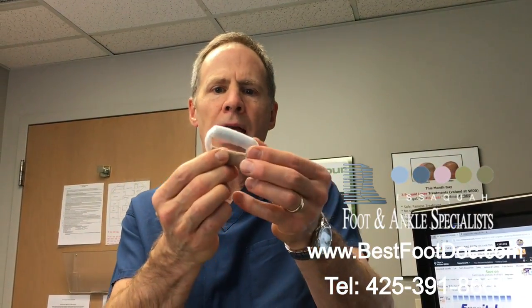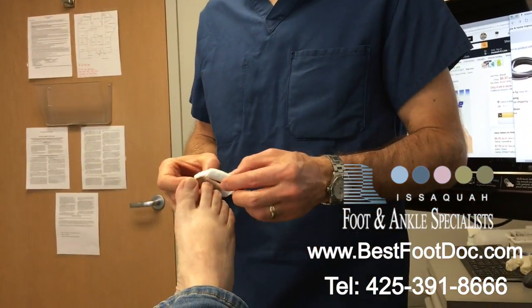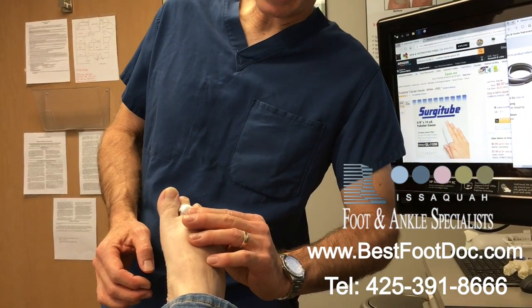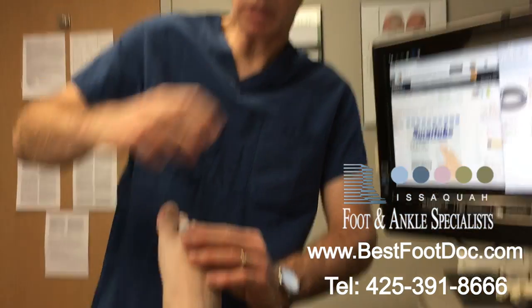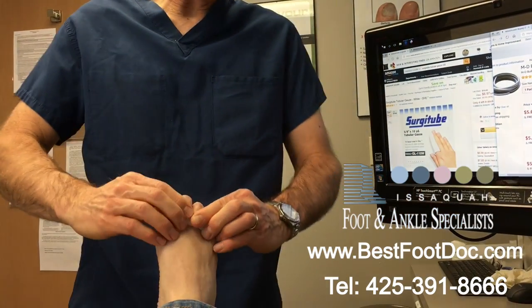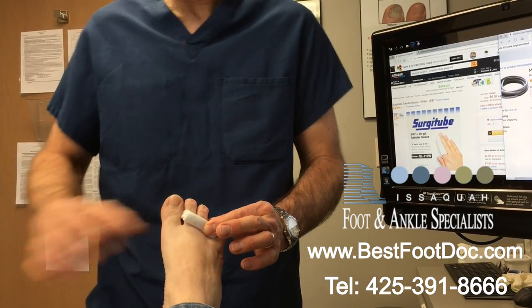Now you've got this little double-sided tube. You can experiment — I can push that little tube in there to make it more even. The cool thing about this is when you put it on the foot, part of it in the shoe pushes this down when someone has a hammer toe, and it pushes the front of the toes up. It works really well and they're quite comfortable, because it's gauze and this tenoplast.